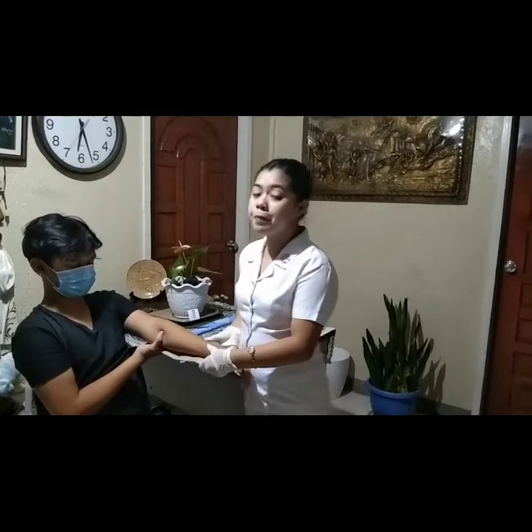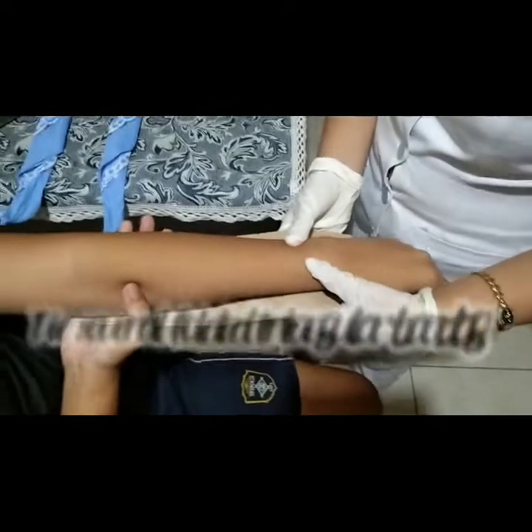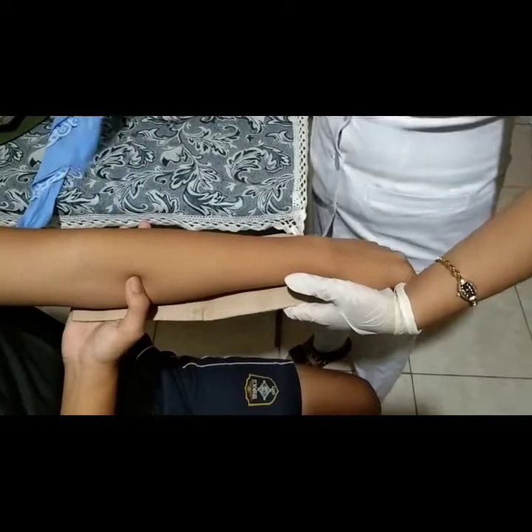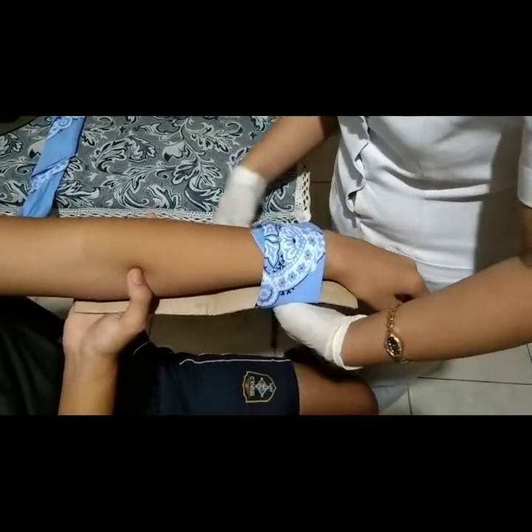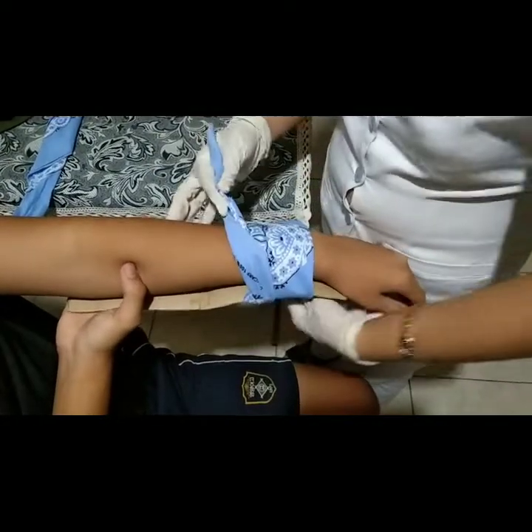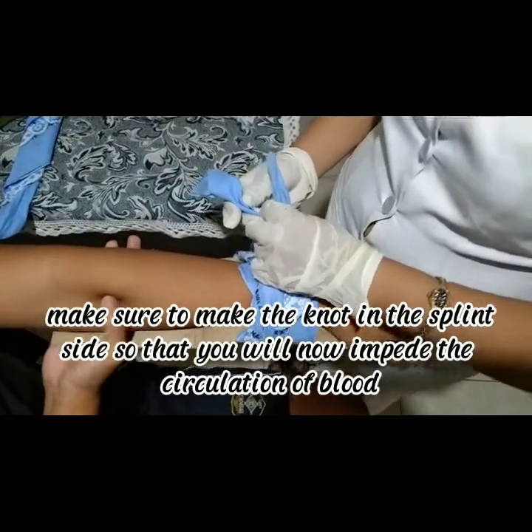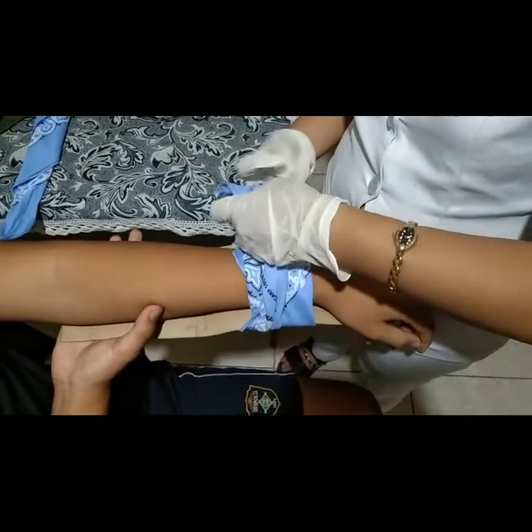The next step is to secure the bandages. Tie several folded triangular bandages or any available cloth above and below the injured body part. Make sure to knot at the side of the splint so that you will not impede the circulation of the blood. So it should be knotted at the side.